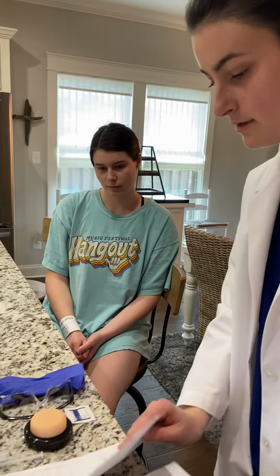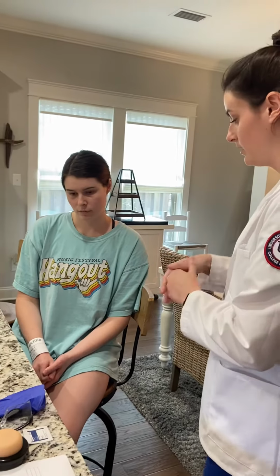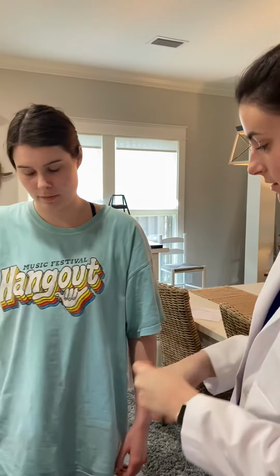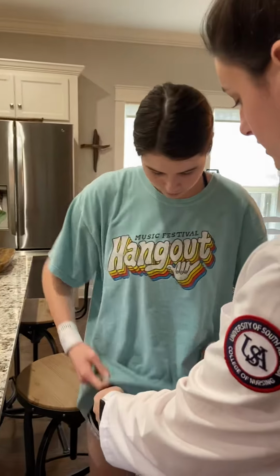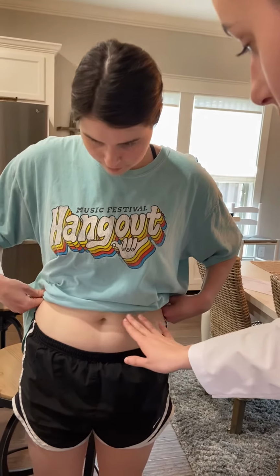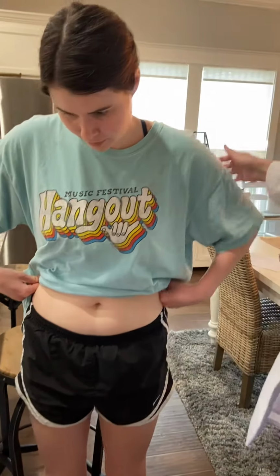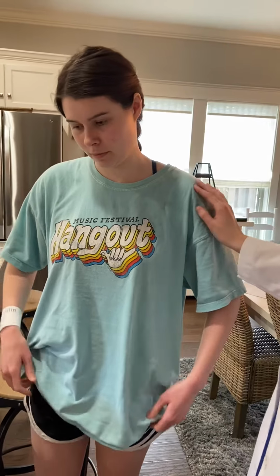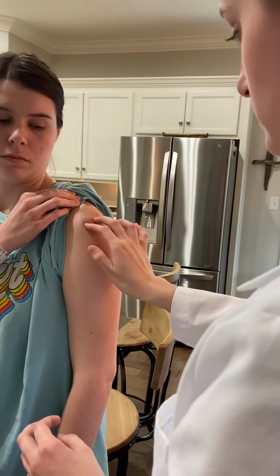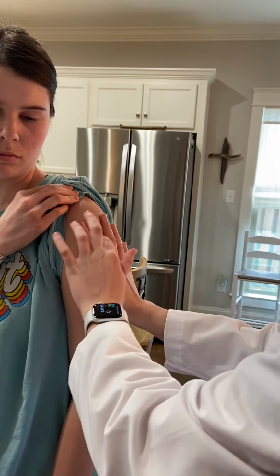All right. So I'm going to perform my hand hygiene again, and can you stand up for me? I'm going to locate where I'm going to be injecting the heparin today. So I'm going to lift your shirt, is that okay? Yep. Okay, so for subcutaneously, I would do it 2 inches to the left or right of the umbilicus, or the top of the thighs, or the back of the arm. And for IM, I'm going to have you lift this if that's okay. I'm going to find the deltoid process, just right about there, and I'm going to put my triangle and I administer right in between my fingers.